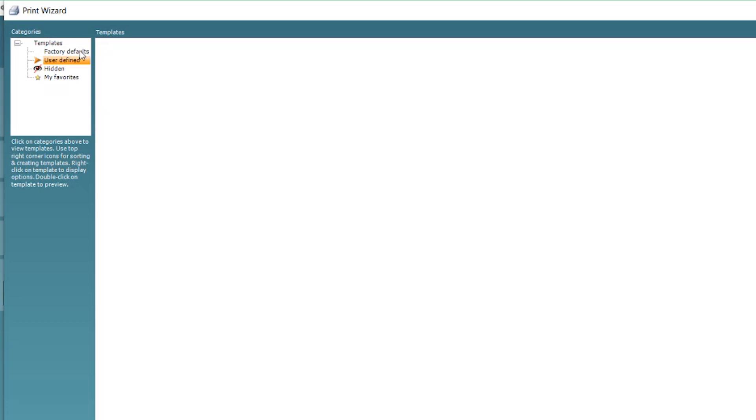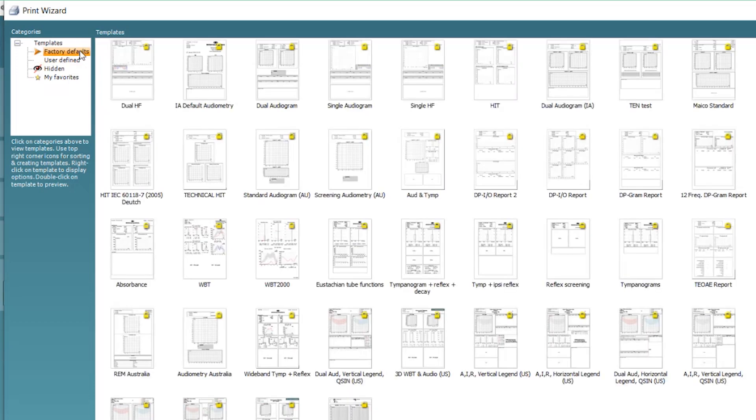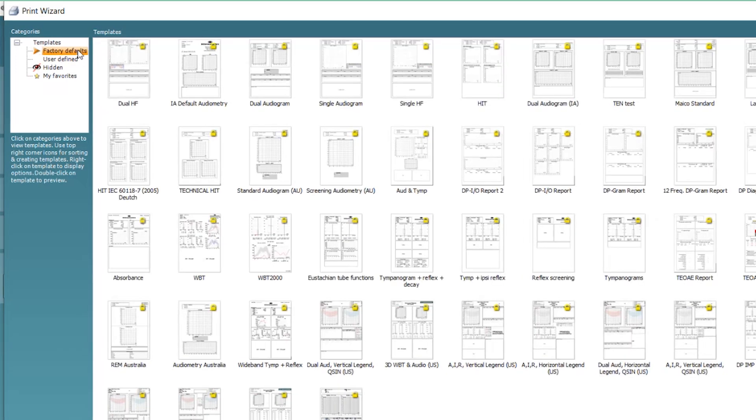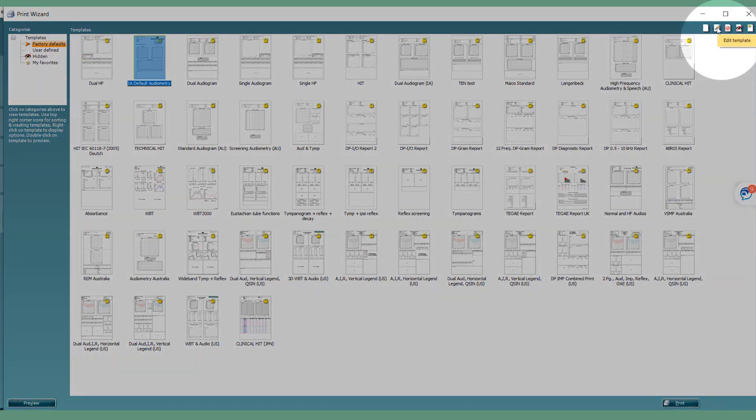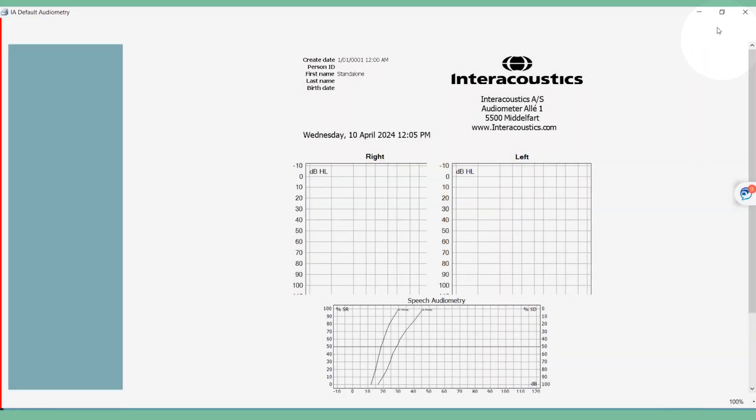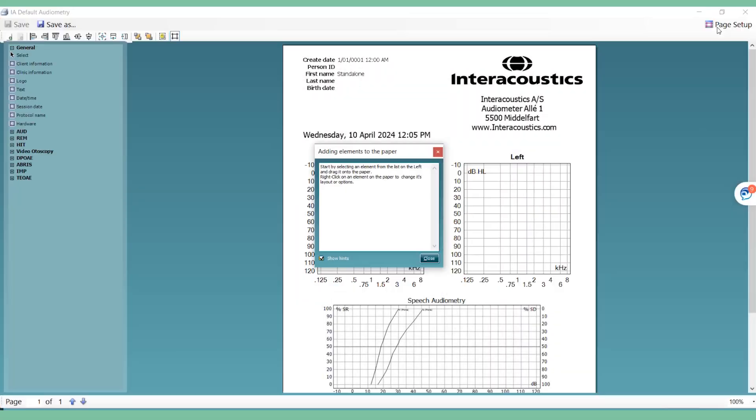If you wish to copy an existing one, open the Factory Defaults tab. Select the print layout closest in design to the one you're trying to create and click on the Edit Template icon in the top right corner. Close the small instructional screen after you have read it.